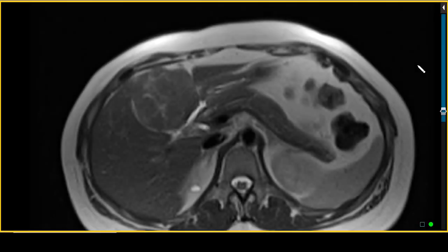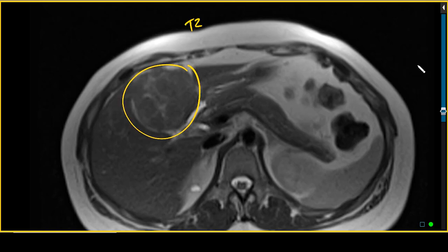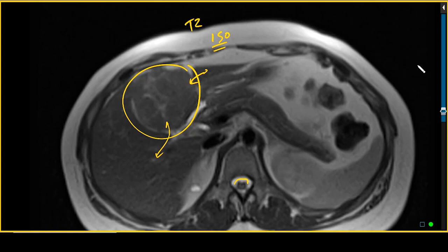We'll start our evaluation of this patient's MRI looking at the T2-weighted sequence performed without fat saturation. We can see a rather large mass within the left hepatic lobe. Looking at its internal T2 signal, it's not particularly bright — certainly not as bright as the CSF. If anything, it looks similar to the adjacent liver parenchyma, so it is iso-intense or minimally hyper-intense with respect to liver parenchyma on T2-weighted images.